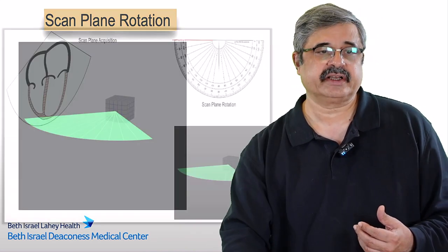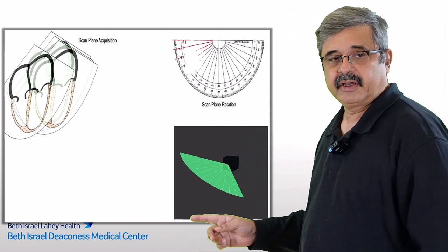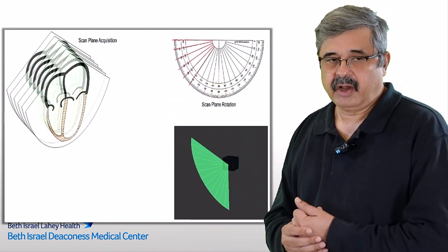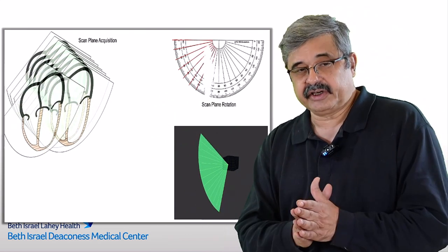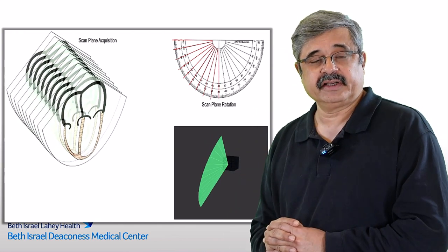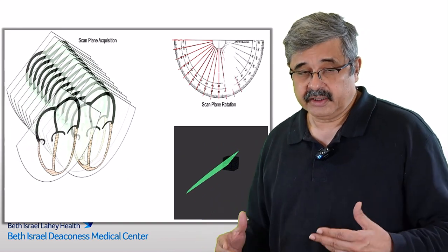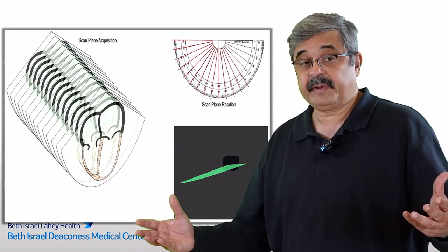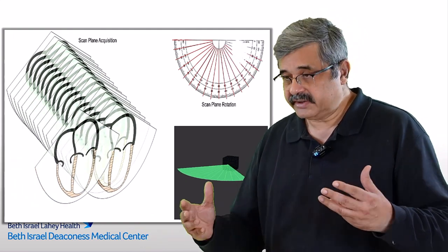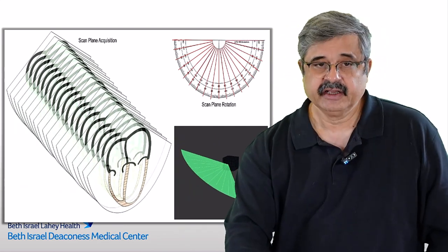Here I'm putting together a series of slices acquired with every scan plane rotation at every five-degree increment. As they're acquired, you can see they are spatially synchronized — the probe was kept at the same place — and by the position of the leaflets and intracardiac valves you can confirm they are all at the same time point. Therefore they were both spatially and temporally synchronized, and the image quality was pretty decent, with gorgeous images as I'll show in the next few slides.